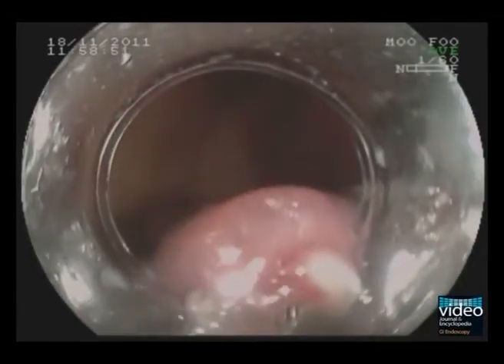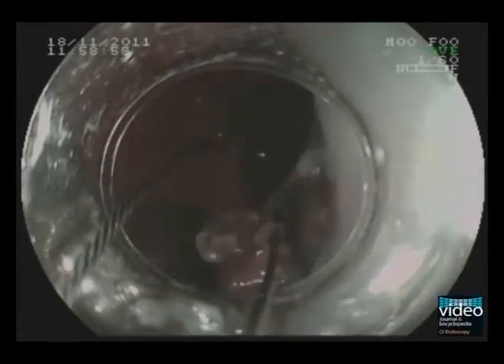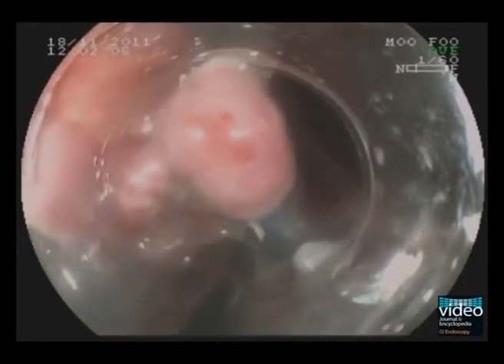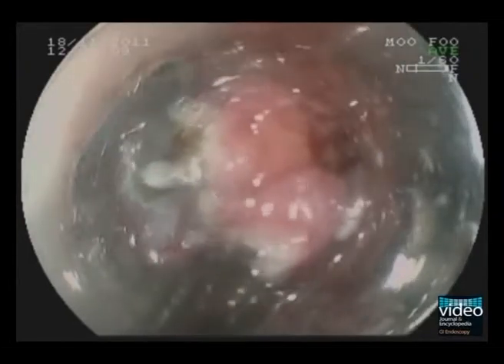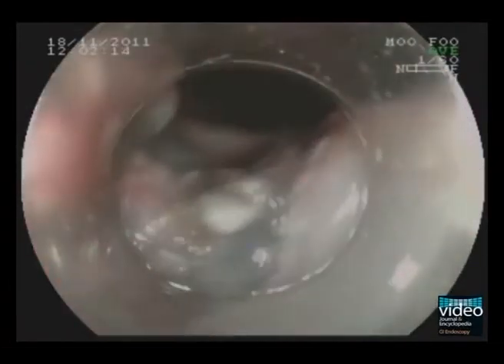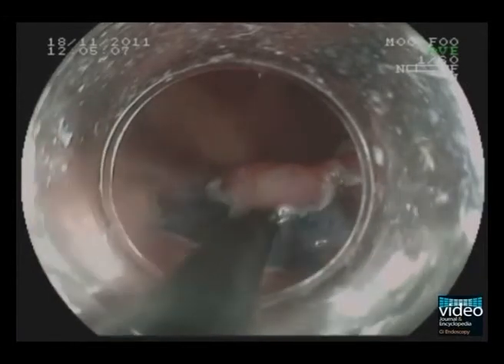The snare is then applied around the previously cut mucosa. As you can see here, it is not yet possible to trap the complete neoplasia with the snare. Therefore, we have to perform some additional trimming with the IT Nano. After injecting some additional fluid, the snare is positioned again.